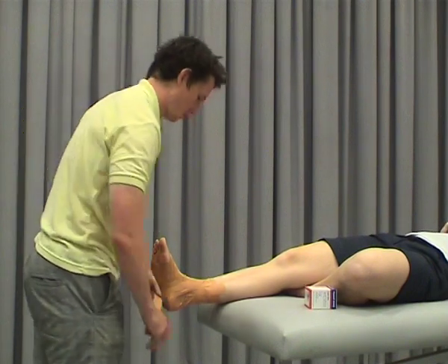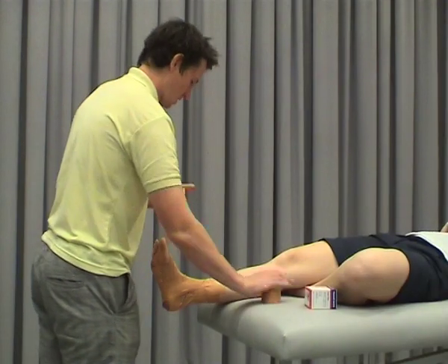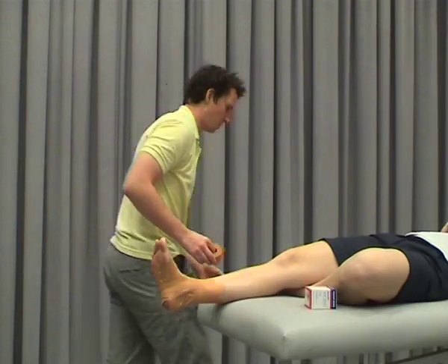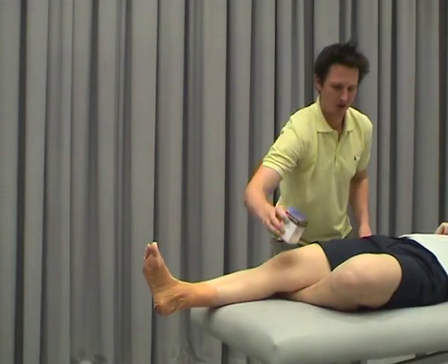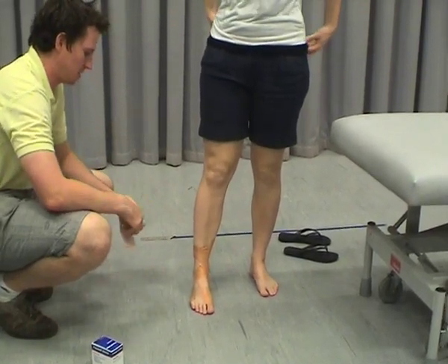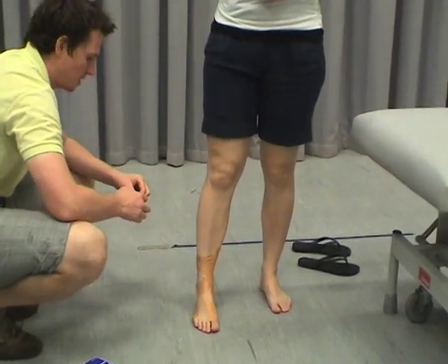Once we've got all that on, we'll then put one more strip over the top just to anchor it all down. We've got one last piece of tape to put on, which we make sure we do in weight bearing — so let's put that down and I'll get you to hop up first. The reason we do this in weight bearing is this last piece essentially helps to hold our low dye tape in place, so we want to use this to anchor it.